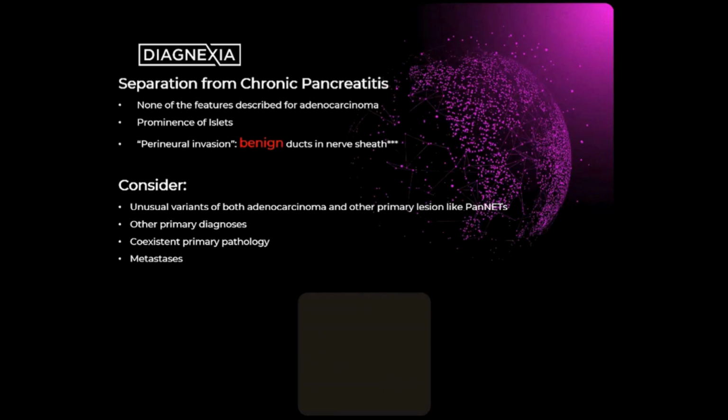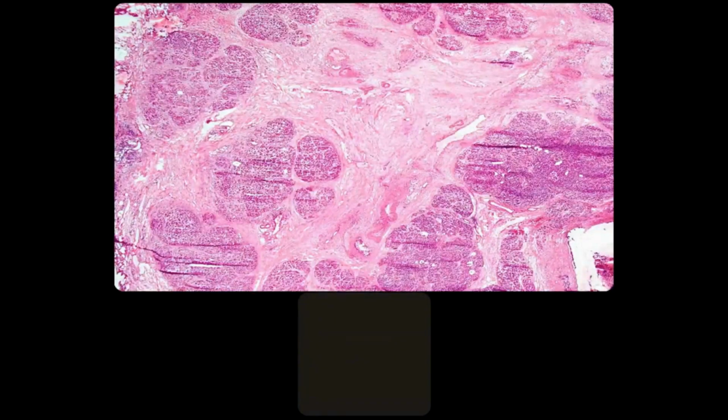So renal cell carcinoma is another one that can present late as a metastasis as well. So just remember that. If the morphology doesn't fit, think outside of the box. Okay, I'm going to end with some images of frozen sections.